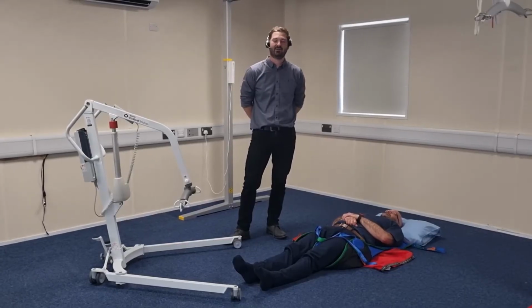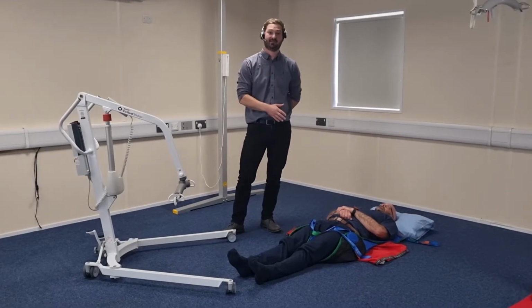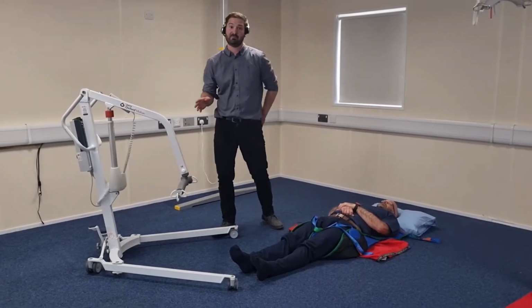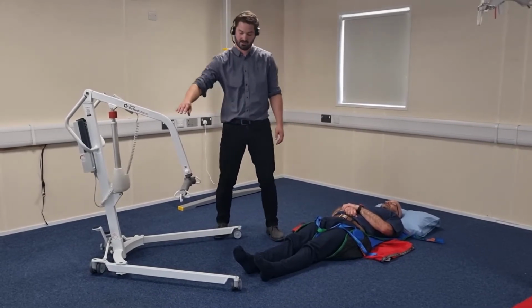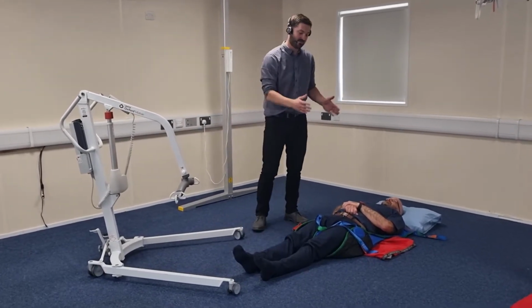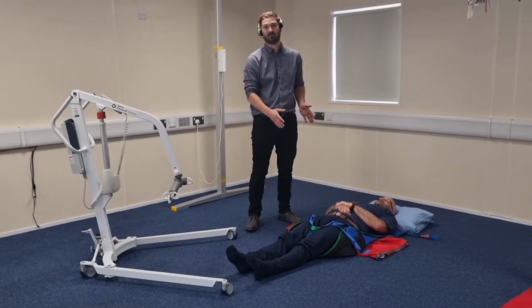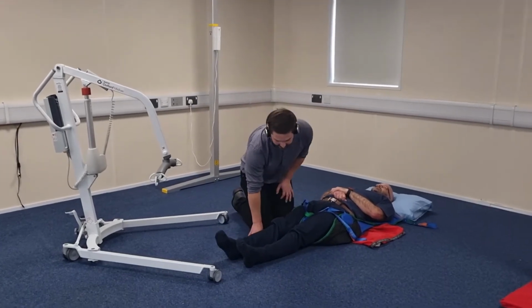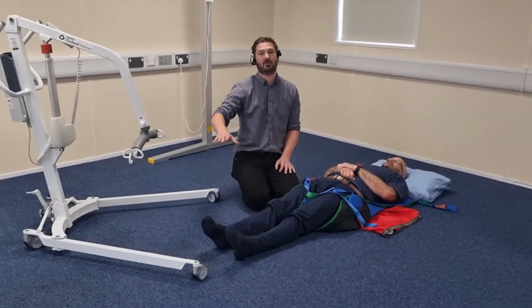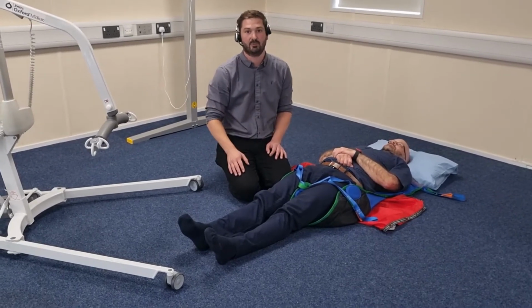So we're now going to look at hoisting a person from the floor, mobile hoist, a full body sling. I'm now going to demonstrate bringing the hoist in from the foot end of the person. Okay, so as you can see, my slide sheet and my sling are already fitted underneath the person on the floor. I'm going to begin by creating some access for one of the hoist legs to pass through, so I can bring the hoist close enough over the person.